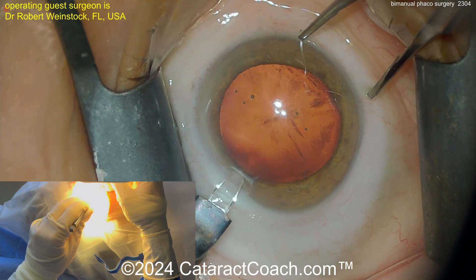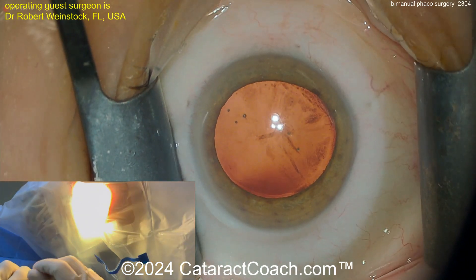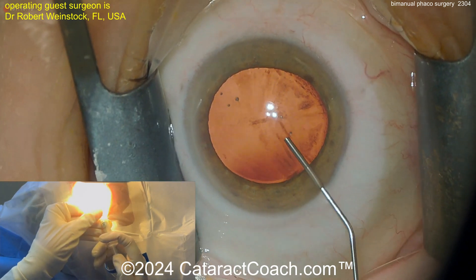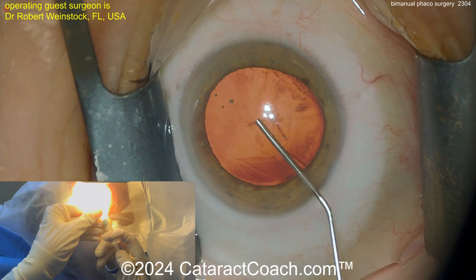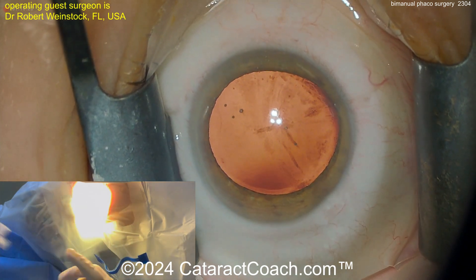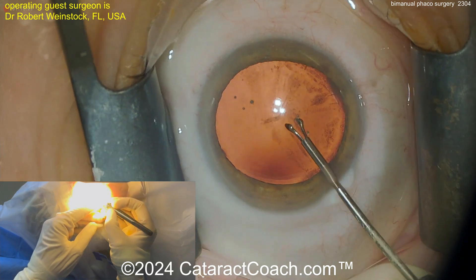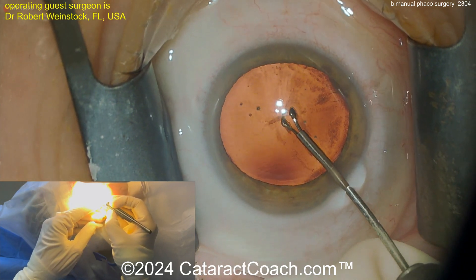At the beginning here, the surgeon is using the same keratome to make two incisions about 90 degrees apart. These two incisions are the same size. The left hand is going to hold an irrigating chopper, whereas the right hand is going to hold a phaco probe with no silicone sleeve on it.